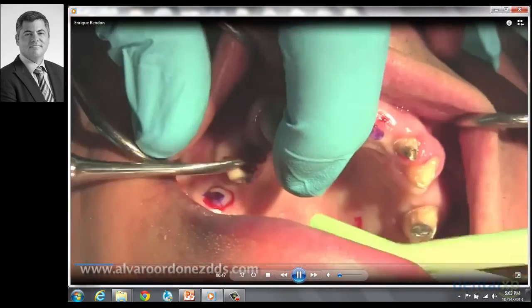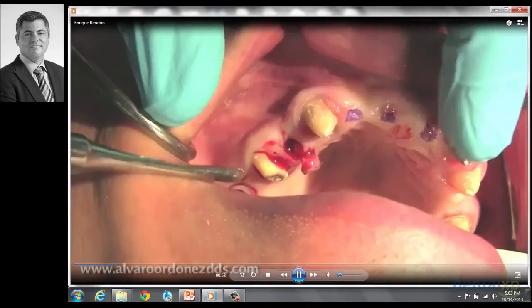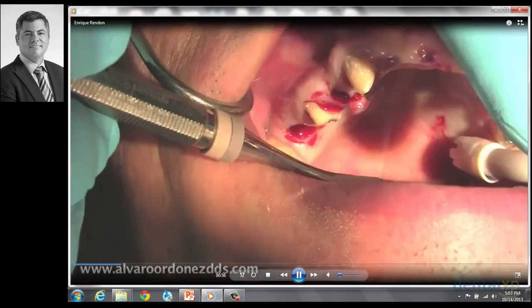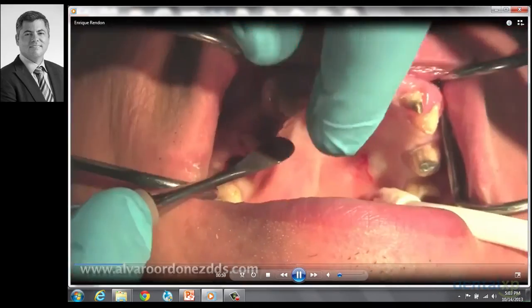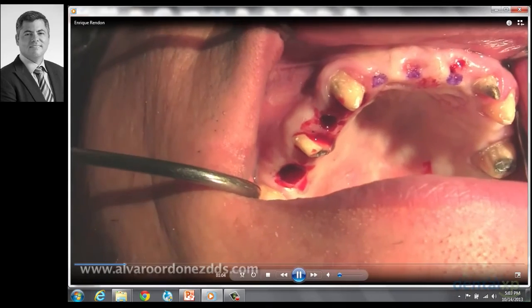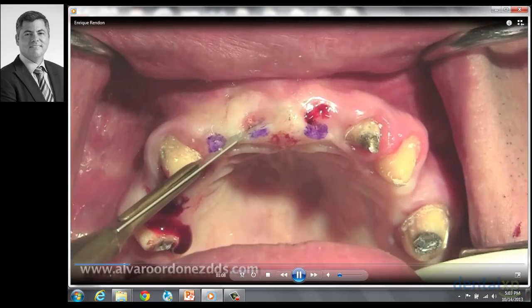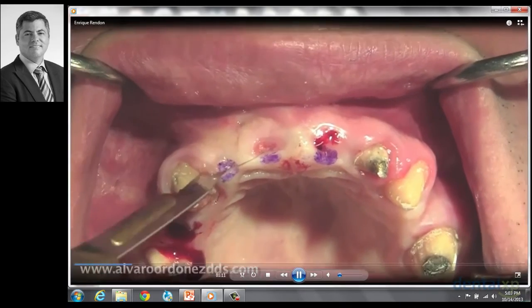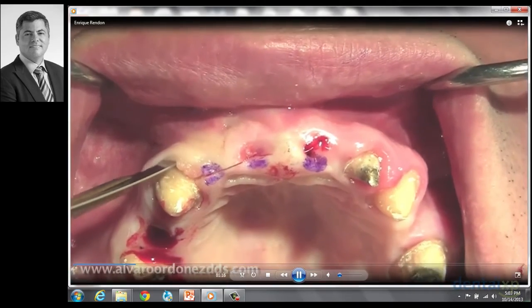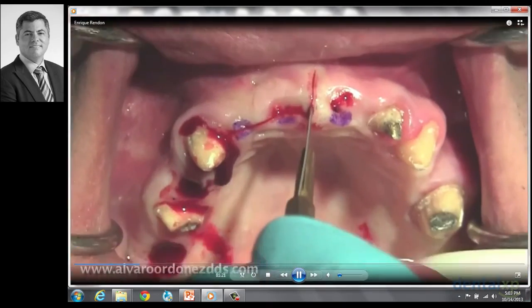Look at the beautiful quality of the adjacent soft tissues. We're able to get a nice regeneration of the area. Look over here. Beautiful tissues, beautiful. I'm very happy with the result. In this area, remember the big defect that we had in the beginning. Look at the nice repair, and also remember we had some mucosa over here. We put the PRF, and now we had a beautiful improvement of the site.